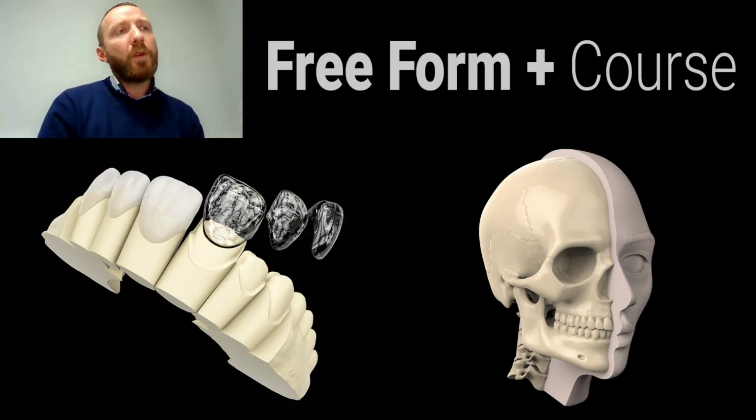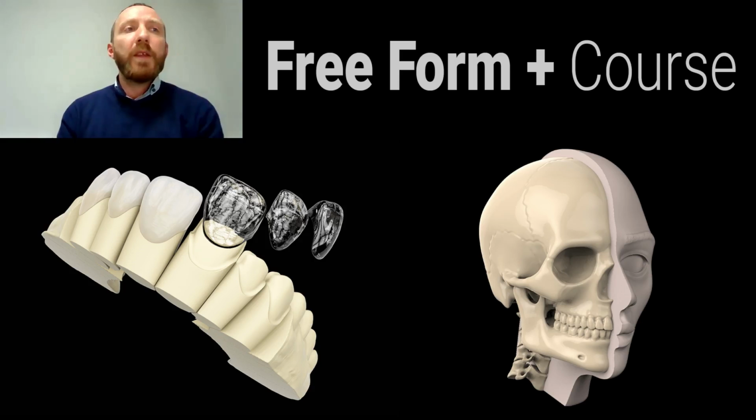This software allows you to create any design that you imagine. That's why it is very convenient to use in dentistry, surgery, and facial design.